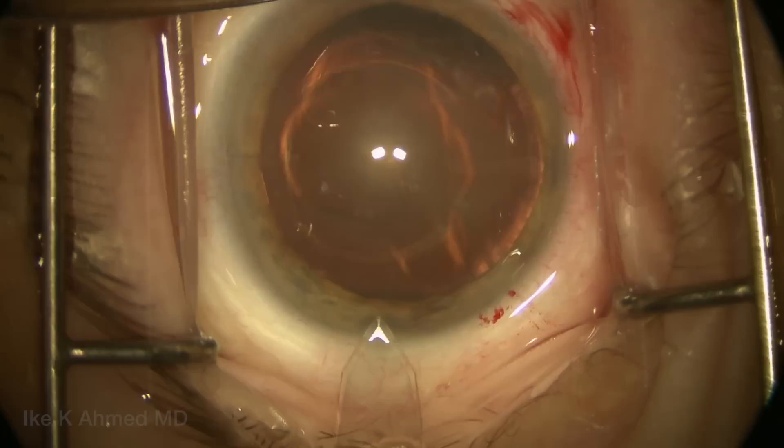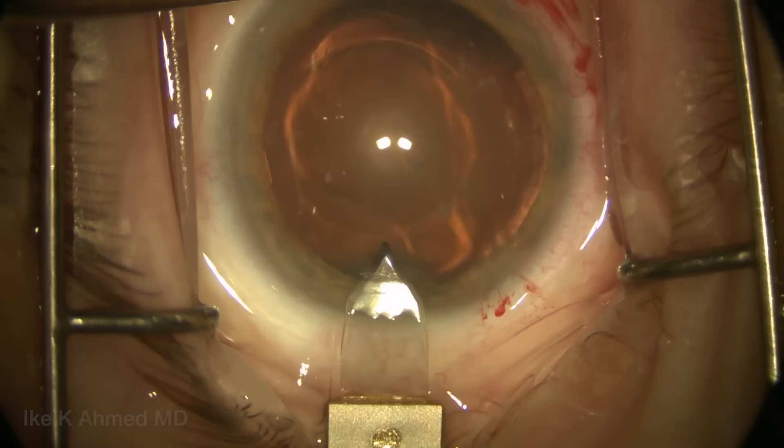The cataract procedure will be performed through a temporal clear corneal incision which is made here, and as you can see in this case, a toric IOL is used.